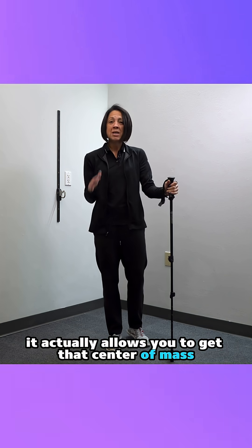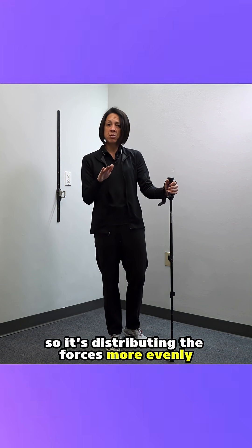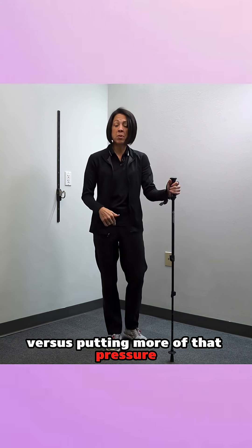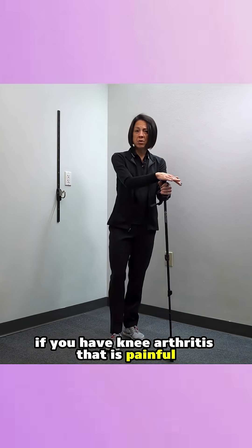What an assistive device does is it actually allows you to get that center of mass — the heaviest part of your body — in better alignment over that joint. So it's distributing the forces more evenly throughout the entire knee joint, versus putting more of that pressure onto the inside of the knee.